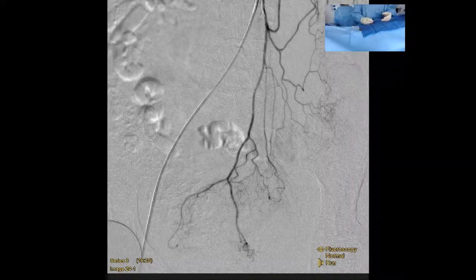There's two main in her, left and right superior rectal, but oftentimes there's four most commonly, so anterior and posterior, right and left. The only reason we have this image is really to get our microcatheter down to above that bifurcation, and then we'll do our selectives. So you use this as a roadmap? Yep. To get down. This will serve as a roadmap for the selectives of each of those. You got it. So we're going to work our microcatheter down. We're just getting that set up right now.